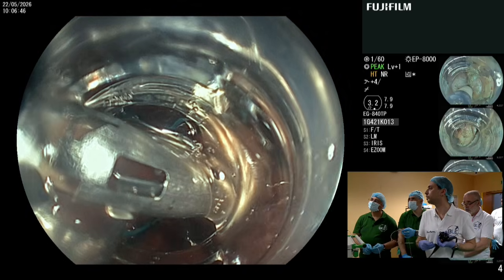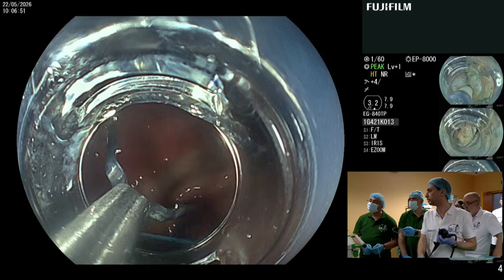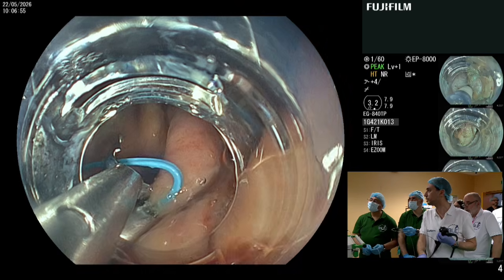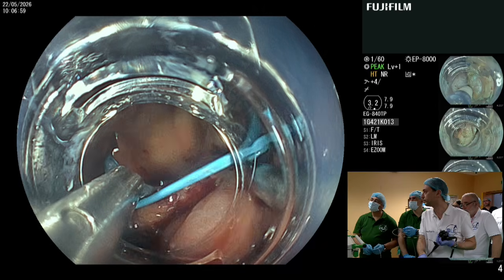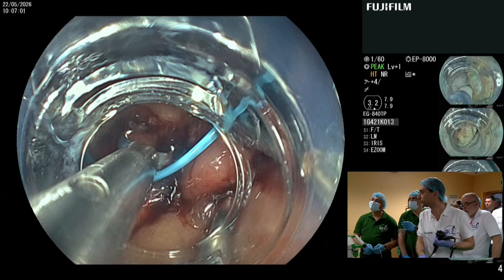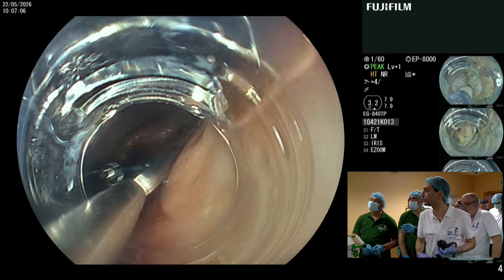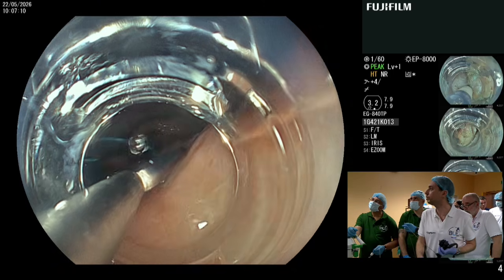I don't see. Open. I will have to go behind the lesion. Ah, yes. Here. Better view. All right. But this is, wait. This is the right part of the endoloop. We need the left. Or we can fix first the right. Yes, I'll do that.